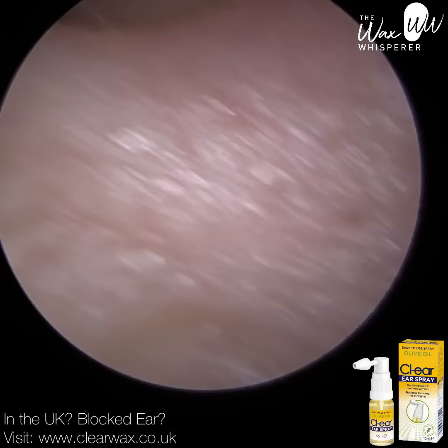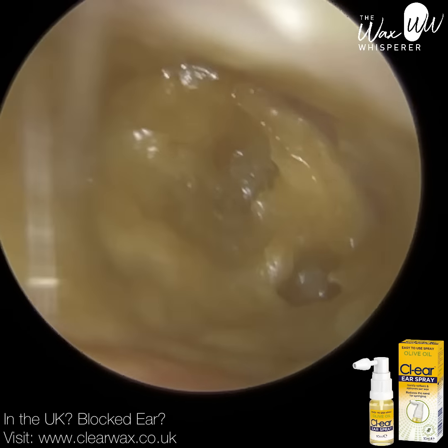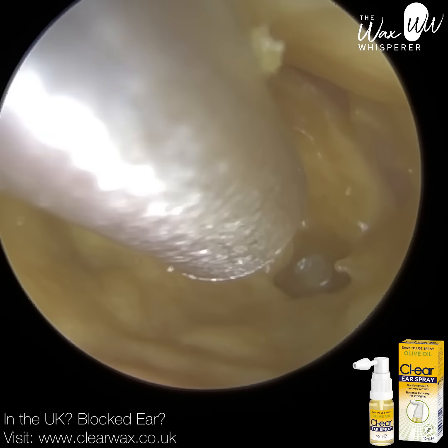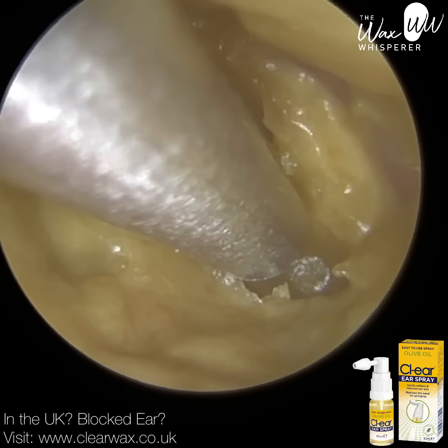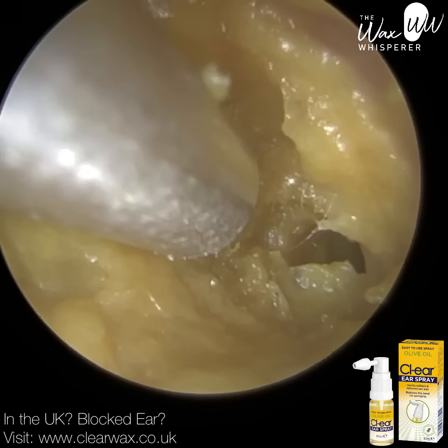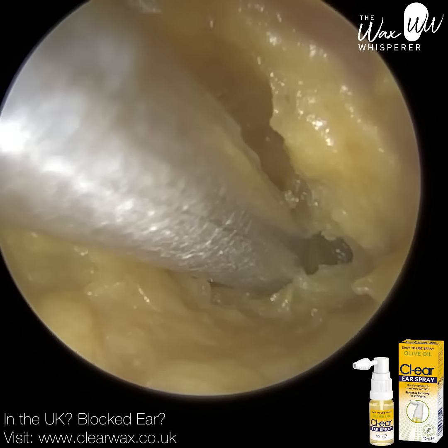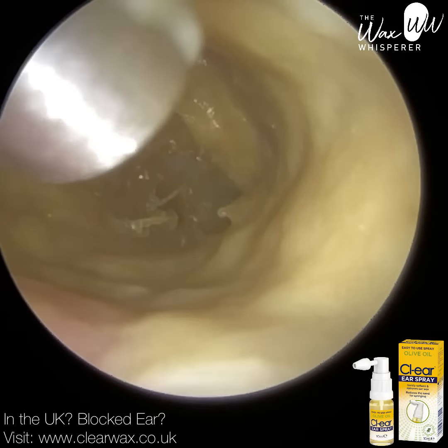This is of a patient who attended with an active ear infection in their left ear. In addition, they also had some earwax that's also become infected. So it is possible for earwax to be infected. So this is a collection of earwax, dead skin, and a bit of discharge, but you can see here, I'm just using the Zollner suction probe.